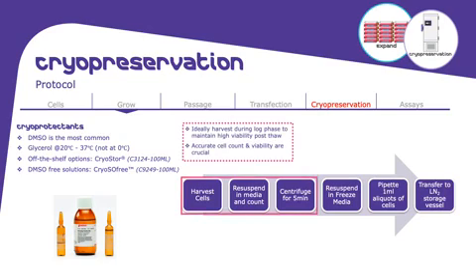First, as we mentioned, we harvest the cells, and as I showed you before on a growth curve, we harvest at the end of the logarithmic phase because this is where the cells are absolutely at their best. Resuspend them in the media, and it is very important to count the cells and make sure that you have an equal amount of cells in each and every vial. Please also do put it in your records, so even if you leave the lab and someone new comes, they will be able to know how many cells you have in that vial.